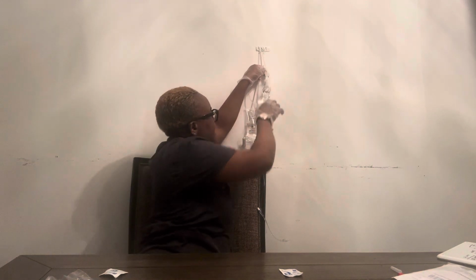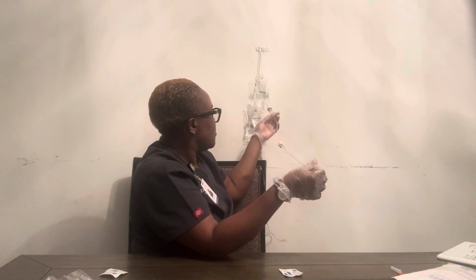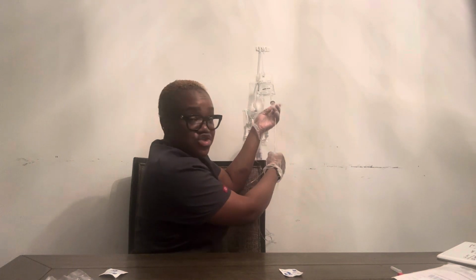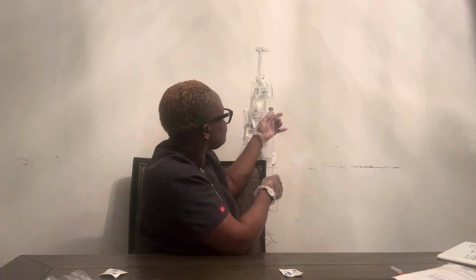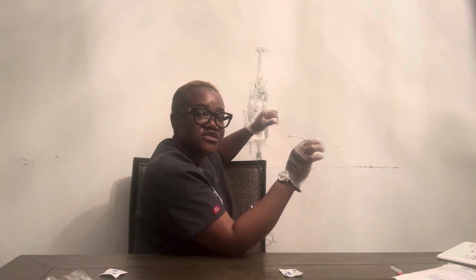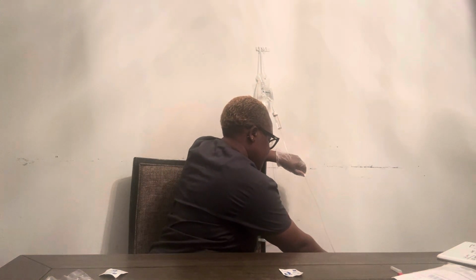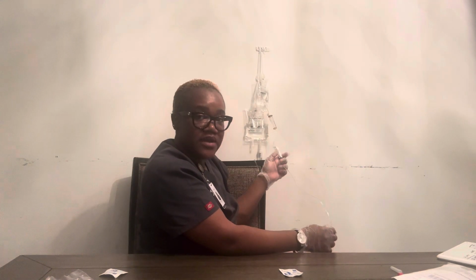All right, so again, I have to prime my line. In order to prime the line, I'm gonna squeeze my drip chamber until it's half full. Okay, so I'm gonna open my roller clamp and allow this to run all the way through into my trash can. Now that I have removed all the bubbles, I'm gonna close my roller clamp.